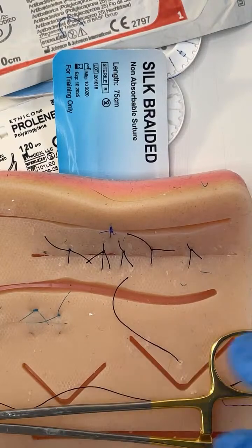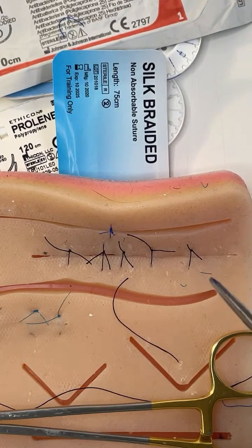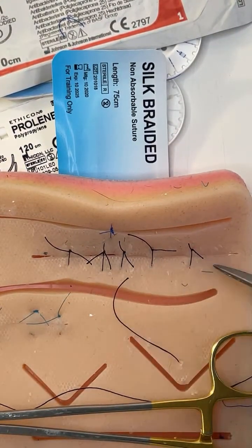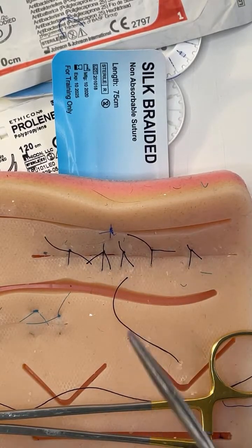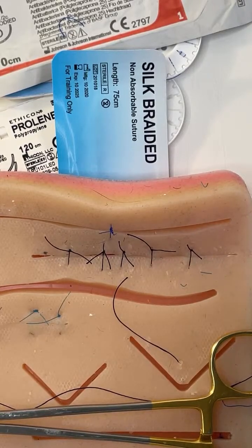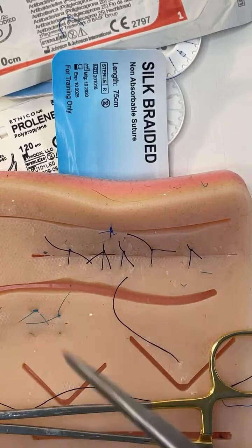So what would I then do once I close this wound? I've closed it in halves. I don't want many stitch marks, but I want the wound to stay well healed and not stretch over time. Rather than in two weeks telling the patient to have all the stitches removed, I would say have alternate sutures removed — so I've still got some control of the tension — and then at three weeks have the rest removed. You'll still get some stitch marks because I've used non-dissolvable sutures, but by taking out half first, you should get less significant ones while still maintaining some wound control.